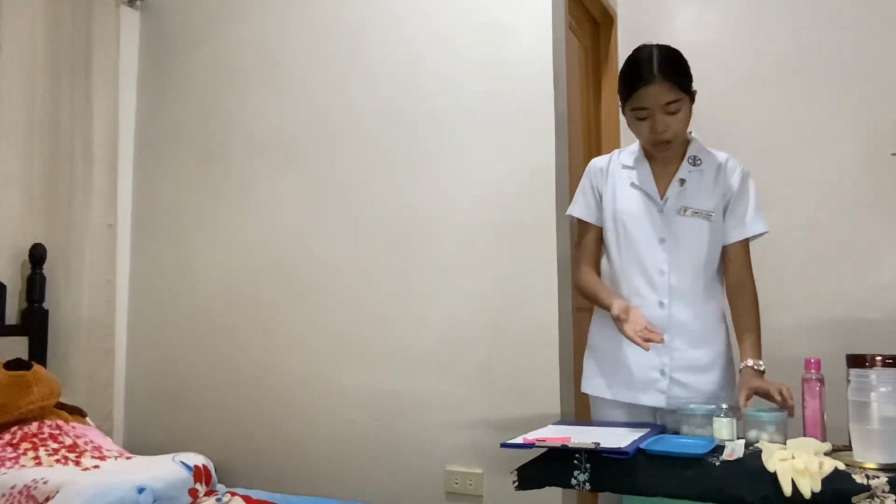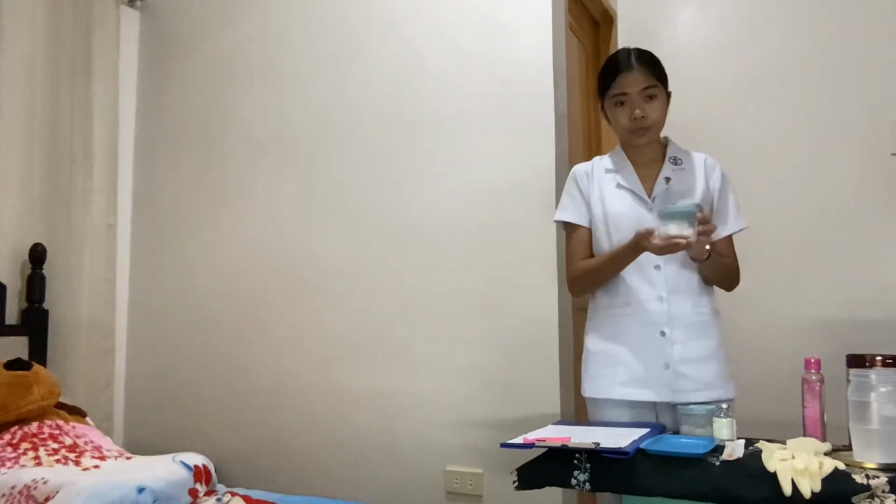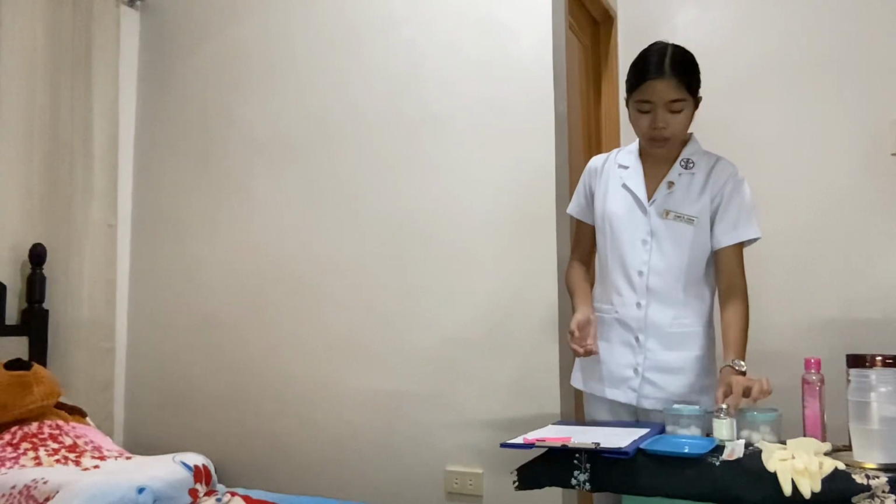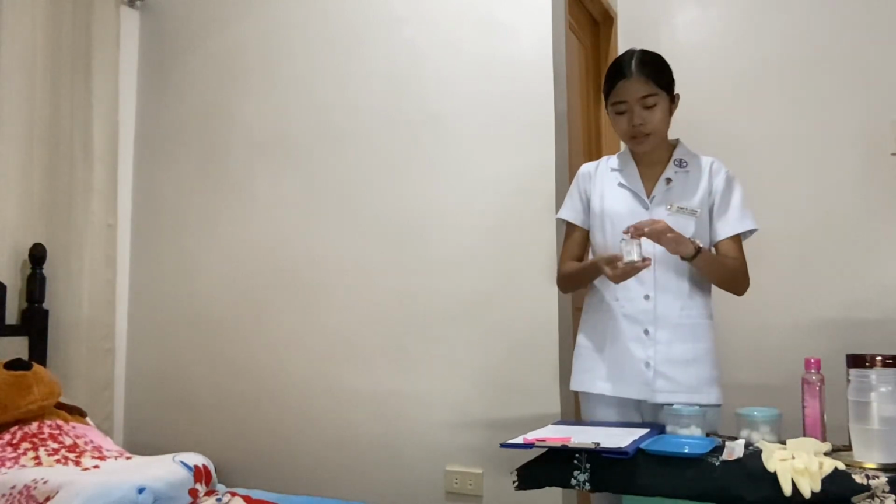We also have our alcohol here, our dry cotton balls, our cotton ball soaked in 70% alcohol. We also have our cotton pad here. Then we also have our sterile water, which will serve as the medication for this demonstration.